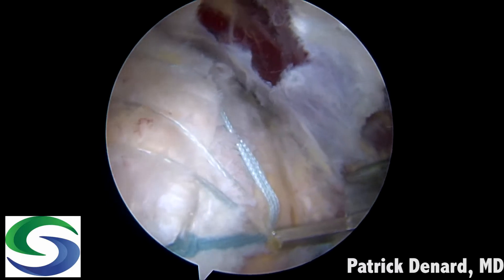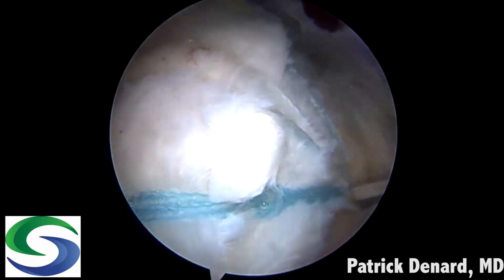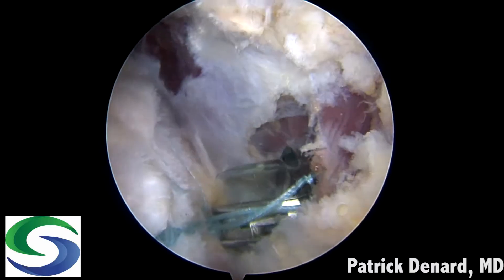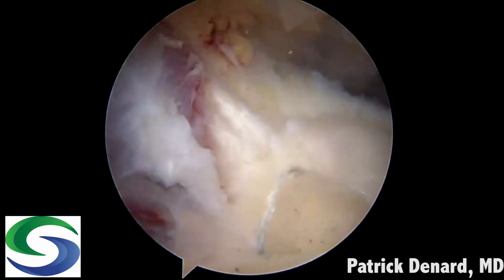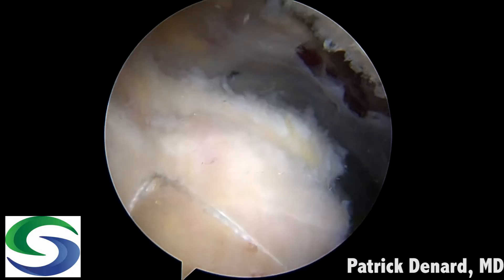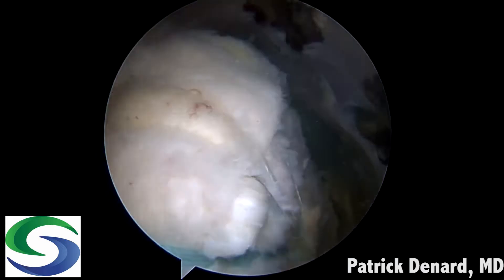A bone socket is created for a knotless swivel lock anchor. We take the fiber link suture anteriorly and posteriorly, as well as the two number five sutures from the medial anchors, out to this lateral anchor — a 4.75 biocomposite swivel lock anchor. Here you can see a knotless low-profile double row rotator cuff repair. This is particularly nice for small tears; for larger tears I'd use a more traditional suture bridging technique with two anchors medially and two laterally.